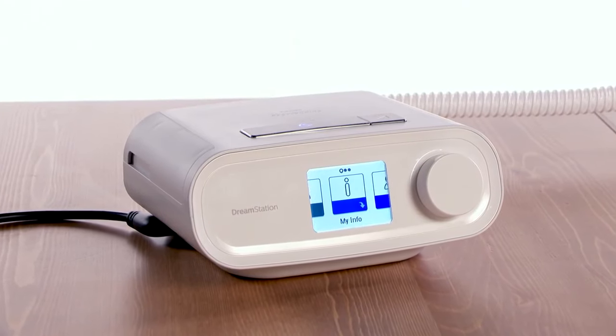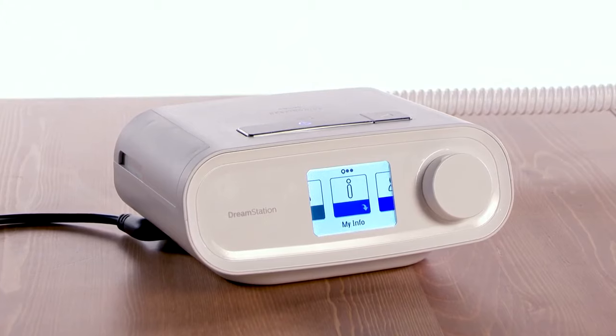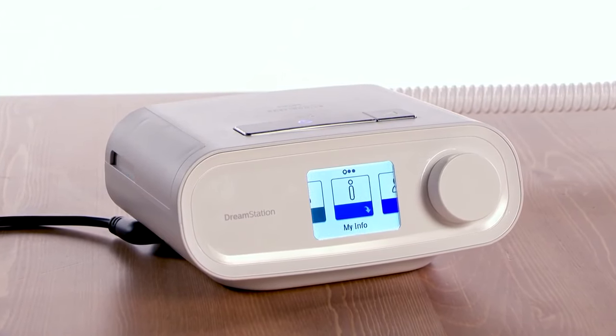Your DreamStation device is capable of transmitting therapy data to your care team through a WiFi accessory modem.